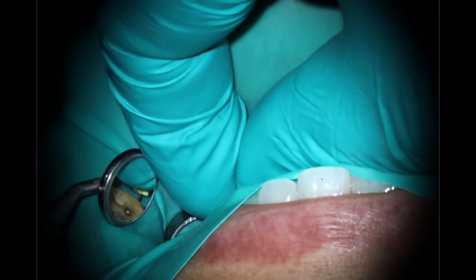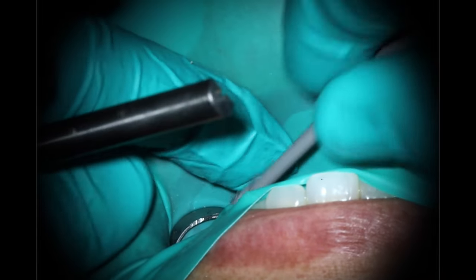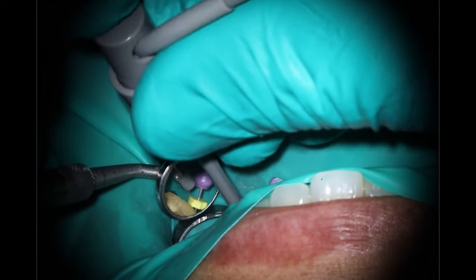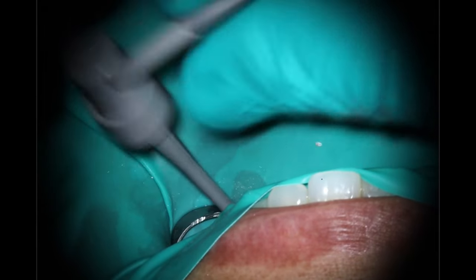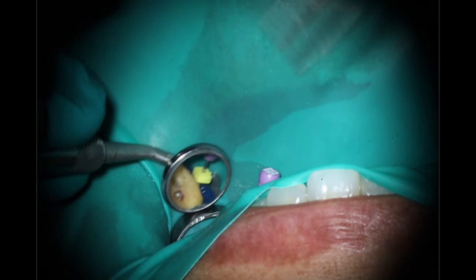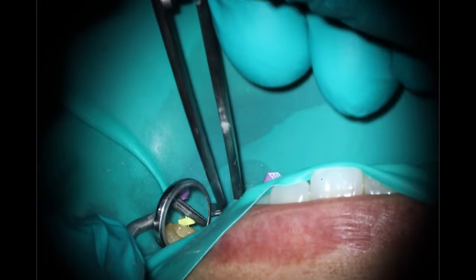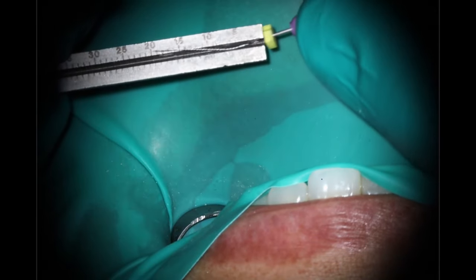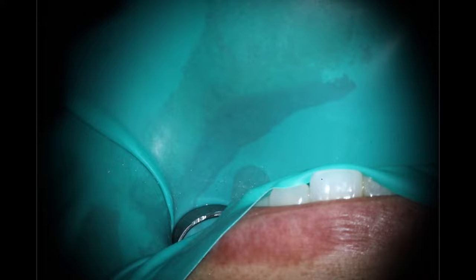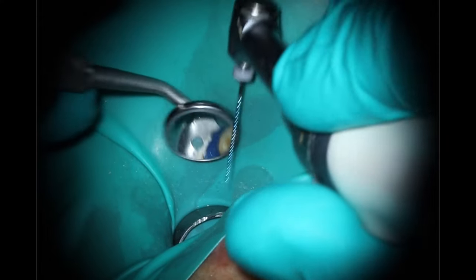So going back in for the palatal, making sure that looks good — going down to about where I can feel. And as you start to do more root canals, you'll feel where the constriction is. Generally if it's a more open tooth like this one was, I can be within a millimeter or two of the apex and just use the apex locator to confirm, make sure everything looks good there, trying to find a stable point to measure from.